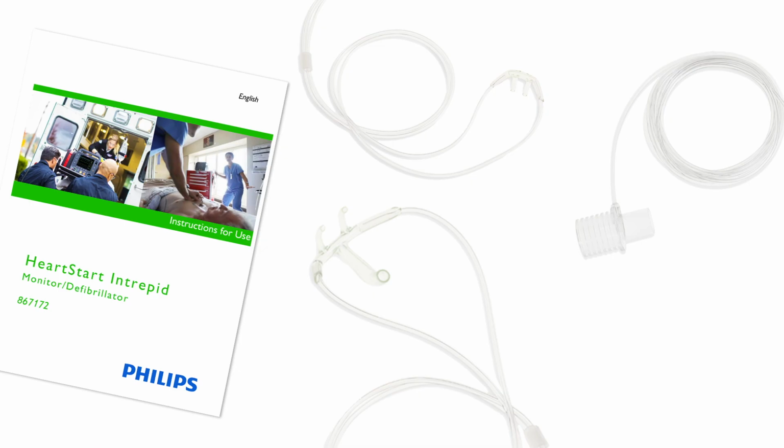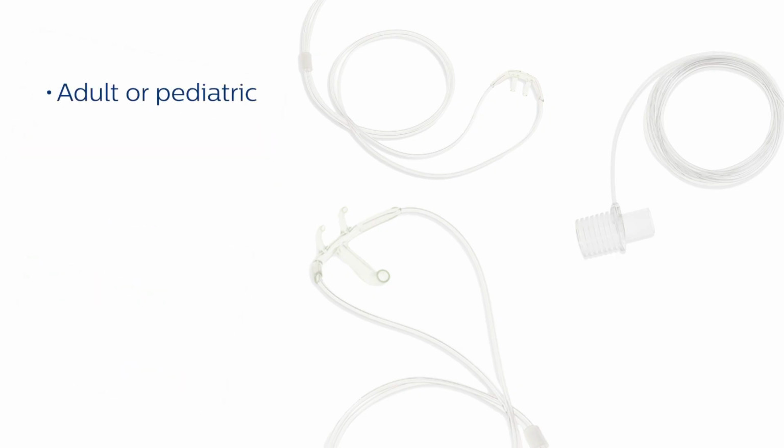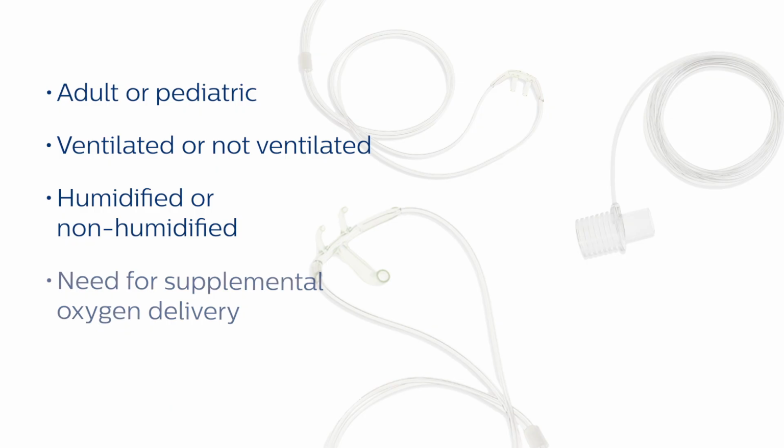There are some factors to consider when selecting accessories for your particular sensor. Patient type, adult or pediatric. Patient airway status, ventilated or not ventilated. And if ventilated, humidified or non-humidified. Need for supplemental oxygen delivery. And possibility of mouth breathing.